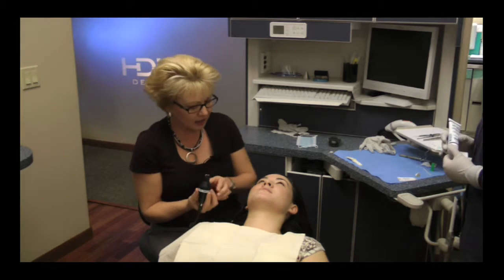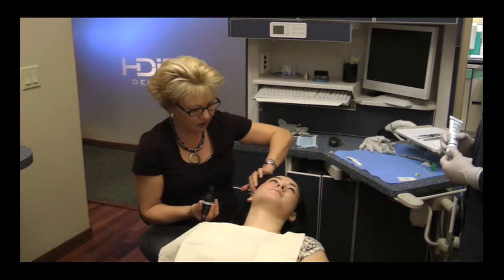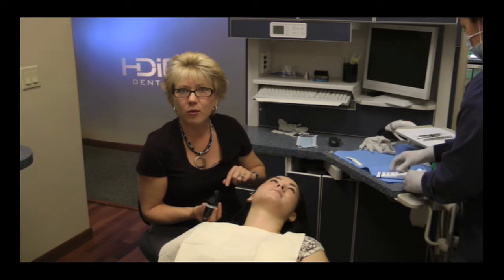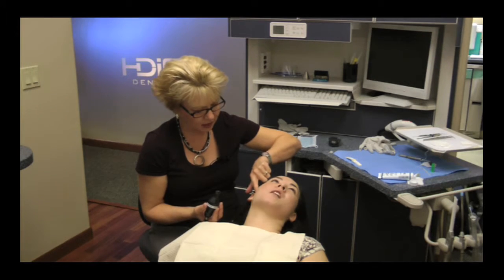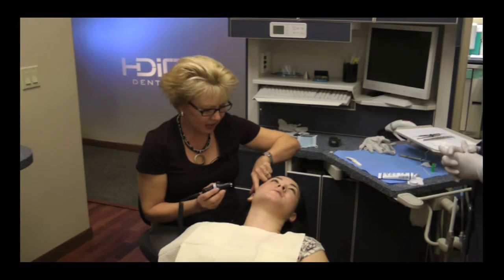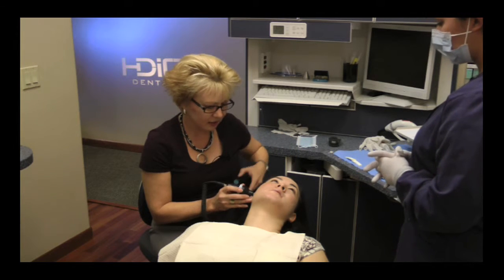Next thing I'm going to do is have her turn her head away from me just a little bit, and I am going to sort of sneak her hair out of the way as best as possible. I want to remind myself where the lateral pole of her condyle was. So I'm going to ask her to open and close once, and close, and find the lateral pole of her condyle. Now I'm going to put the Doppler in place just behind that, and as you can see, not touching her skin.